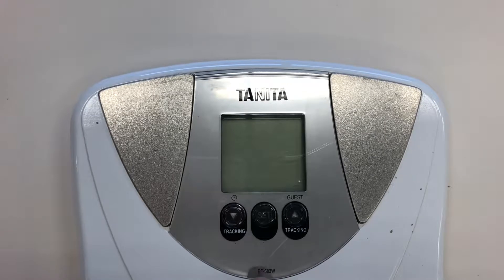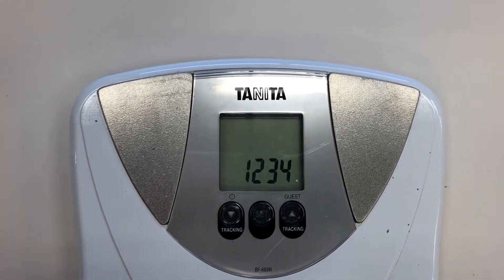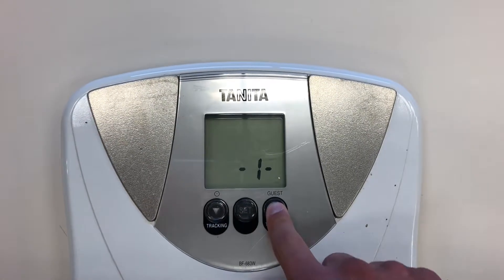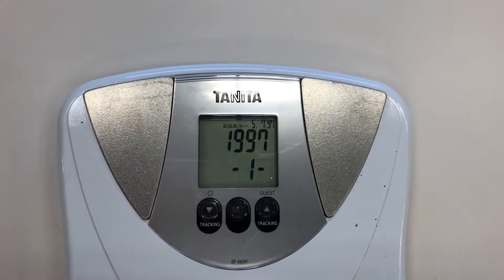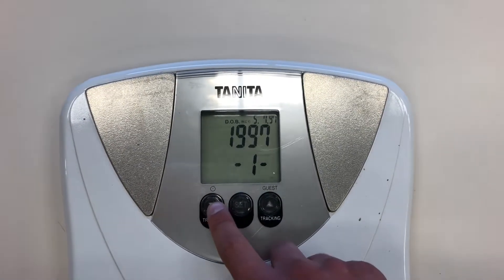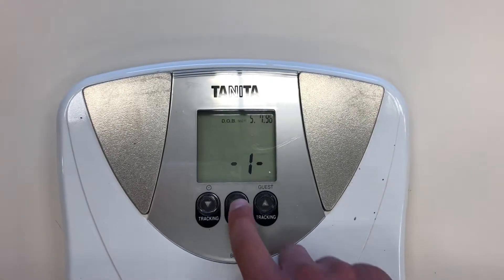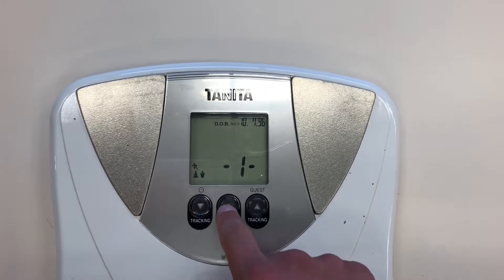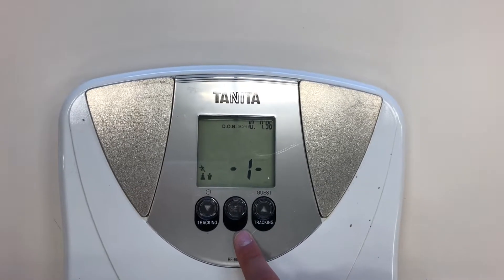In order to program user data, when the machine is off, you're going to press the set button in the middle, and you're going to choose one, two, three, or four. In order to do that, you're going to press the upward arrow key, and then you can press set. Then you're going to enter your user data — it's asking for your date of birth. Click the up and down buttons to set the month, and make sure that you get the proper year as well.